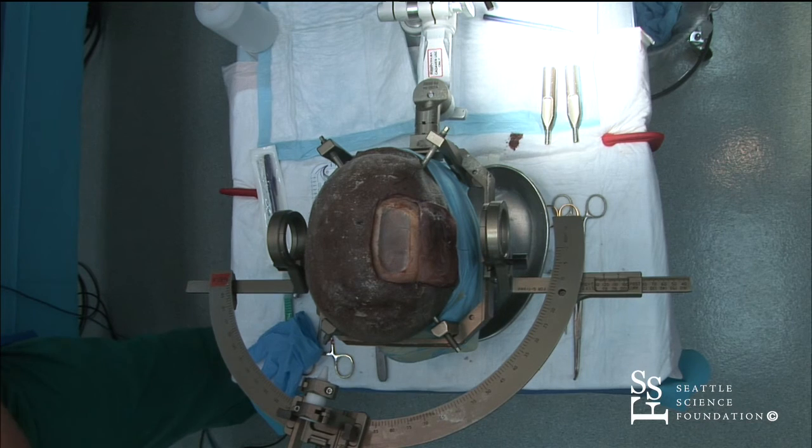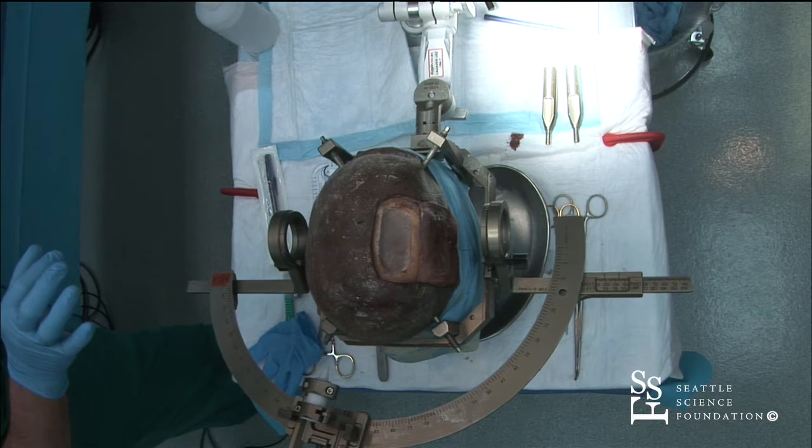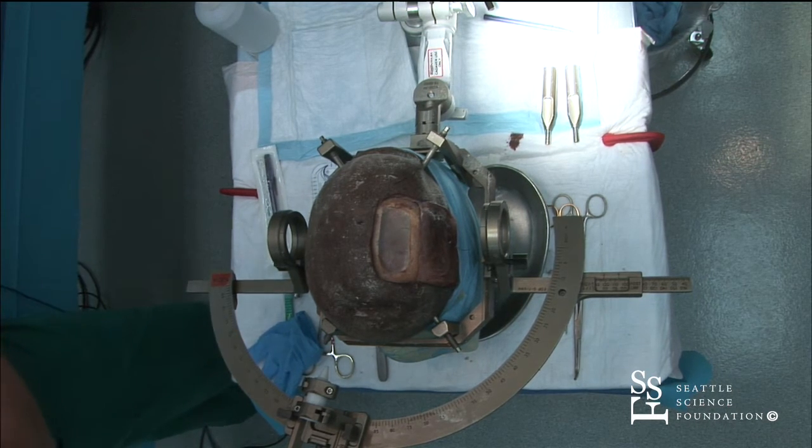I'm only going to show the left here, and you can see that there are 4 contacts of the depth electrode, and there's either a 10 millimeter spacing or a 3.5 millimeter spacing between the electrodes, and we pretty much always use the 10 millimeter spacing with hippocampal depth electrodes, and that allows us to get essentially 1 contact in the amygdala typically, another contact in the hippocampal head, and then hopefully 2 contacts in the hippocampal body. And that's kind of what we're going for.